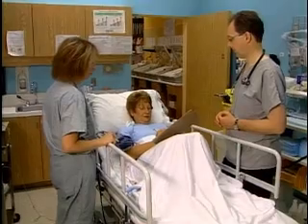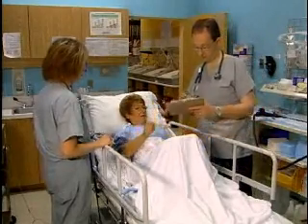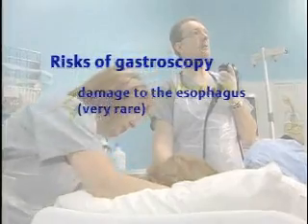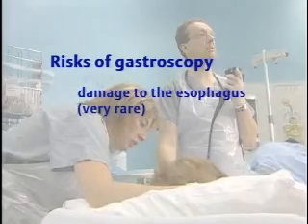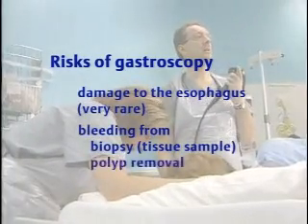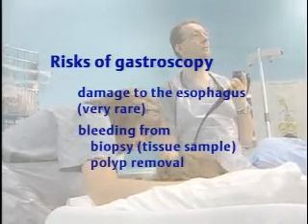As part of the consent process, the gastroenterologist will also explain alternatives to the gastroscopy. It's important to understand that gastroscopy is a very safe procedure, though as with all procedures there may be some risks. There is occasionally some minor damage to the esophagus — possibly a small tear or graze as the scope goes down, but that is virtually unheard of. In some cases there is a risk of bleeding when biopsies or tissue samples are taken, or if polyps — small growths — are removed from the lining of the stomach or duodenum.